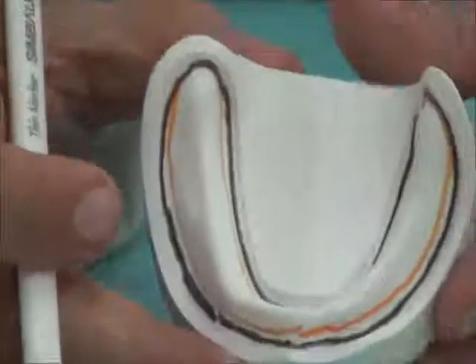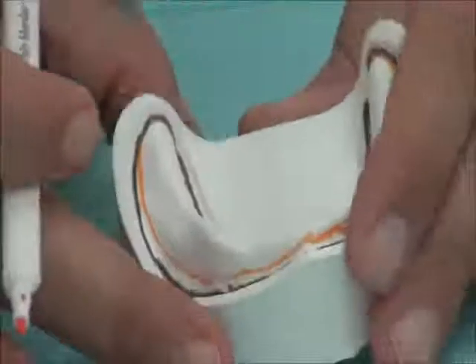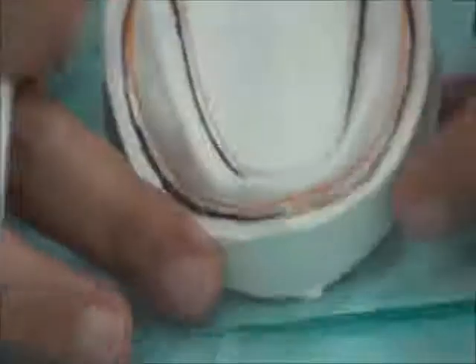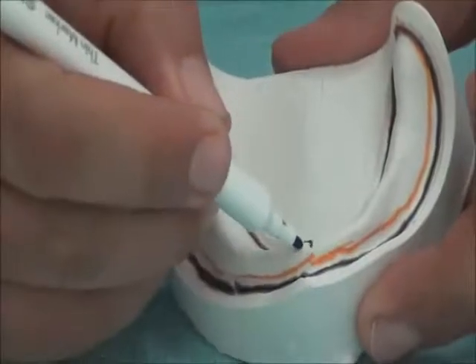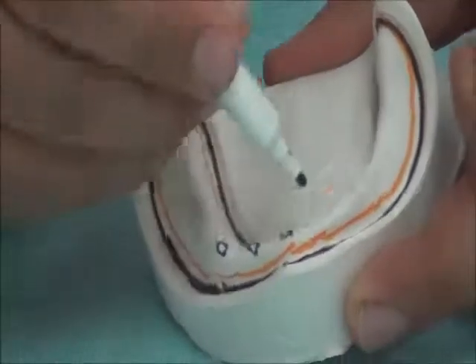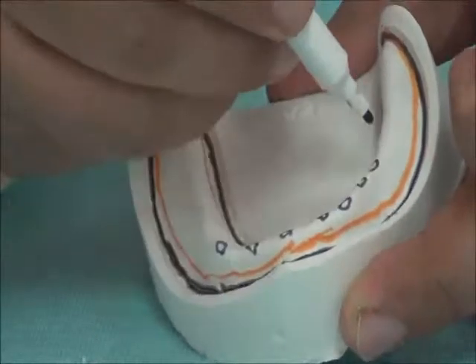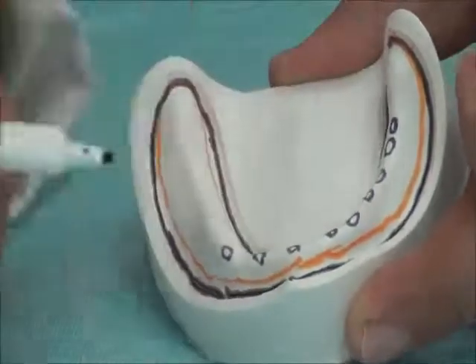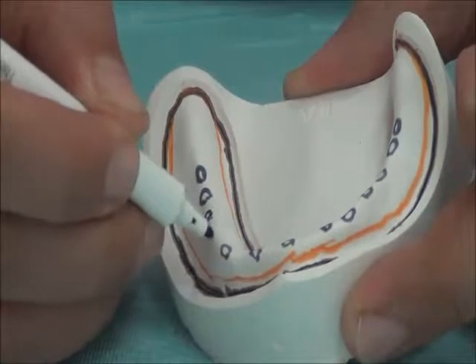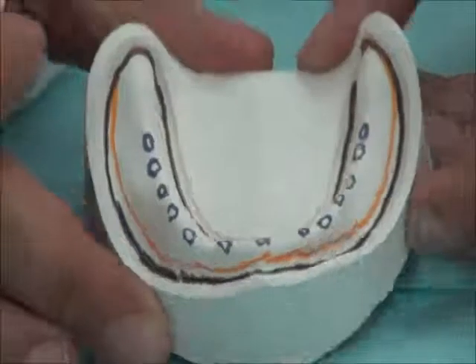for the lower tray. We will make it a full coverage tray with no spacer, but then once we have our material ready, we are going to place holes in the areas where we need to have relief. So the holes in the tray will be over the canine eminence, over the crest of the ridge anteriorly, the canine eminence on the other side, the crest of the ridge, excluding the retromolar pad. The retromolar pad should be compressed in denture impressions. So we can apply these holes in the tray once it's there.